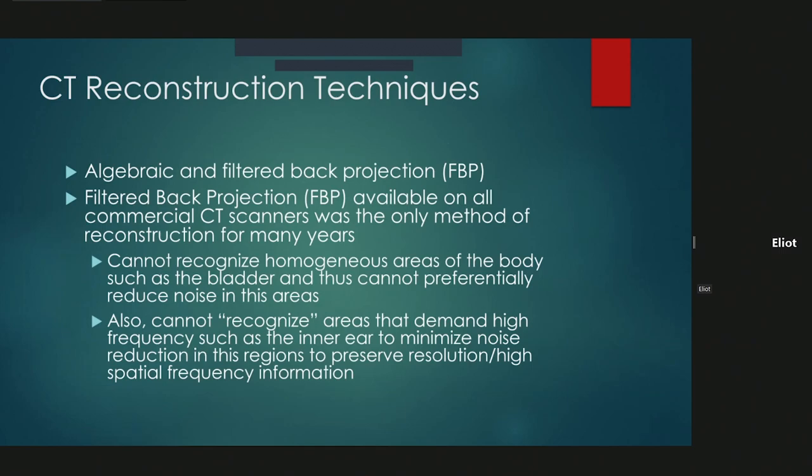With regard to CT reconstruction techniques, there's been a really interesting evolution. And I think in looking at CT quality and opportunities to improve CT quality, it's really important to look at some of the current techniques that are used to reconstruct images in CT and some of their challenges and advantages and disadvantages. With regard to most CT scanners today, filtered back projection is a technique that's available on all commercial CT scanners and has been for many years really the only method of reconstruction.